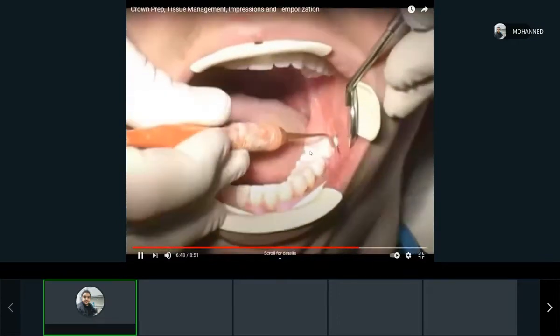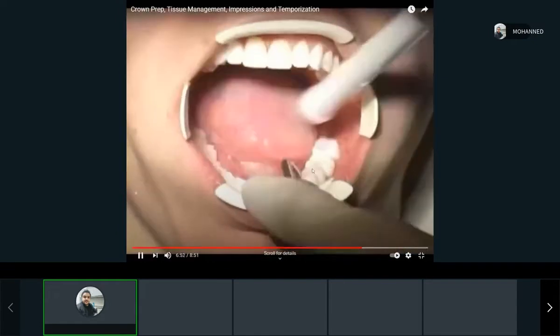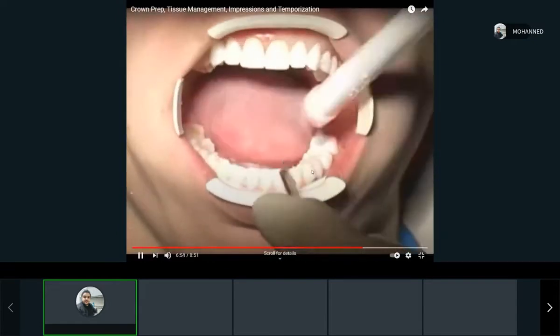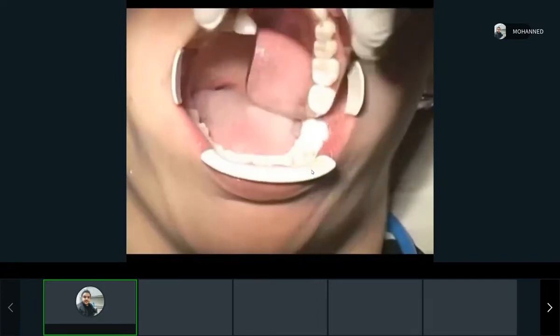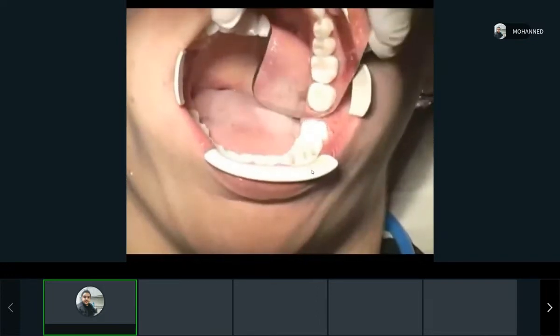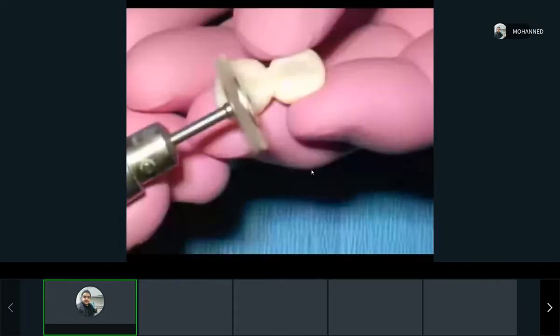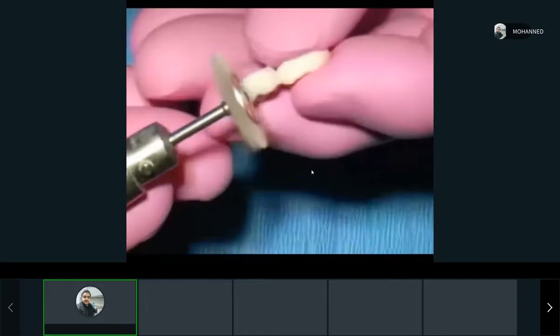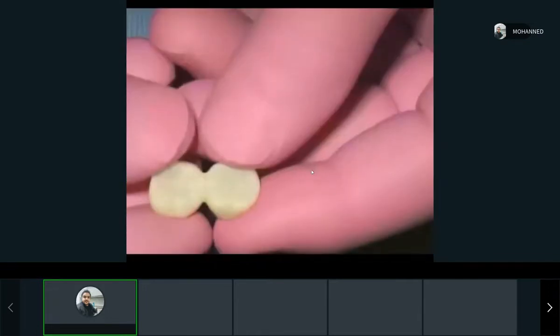And then, guys, we actually can do this. This is something that we can do and most probably you're going to do. So doing the temporary crowns is a good skill to learn and to be able to do. Some of you will be really awesome with it. Sometimes when we make these temporary crowns, the patient will not come back. They think that they're the original ones because they're really nice. They look really good, right? So see, they're now just removing the excess so that we take them out of the bites, smoothing them because we don't want the patient to bite on them hardly. We don't want them to chew on sticky food because they're temporary at the end of the day.